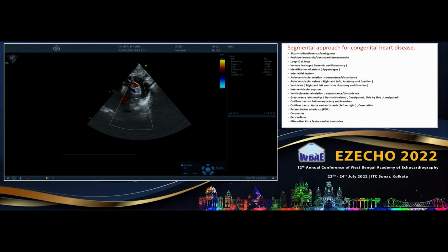So important, we can do a palliation till we get some time to put a conduit repair. So assessment of the duct, its anatomy, insertion, and branch pulmonary artery sizes is extremely important. This I am discussing in the context of tetralogy of Fallot pulmonary atresia. In regular tetralogy of Fallot, again, a lot of things we need to see: the additional VSD, level of obstruction, nature of obstruction, coronary crossing the RVOT, aortic valve dilated or not, and whether aortic regurgitation is present or not.